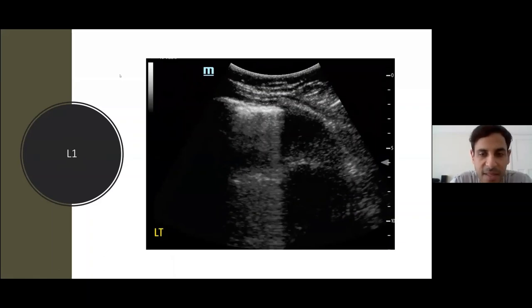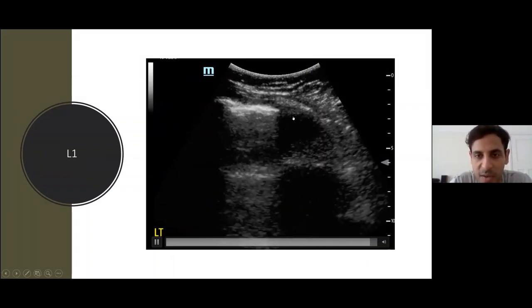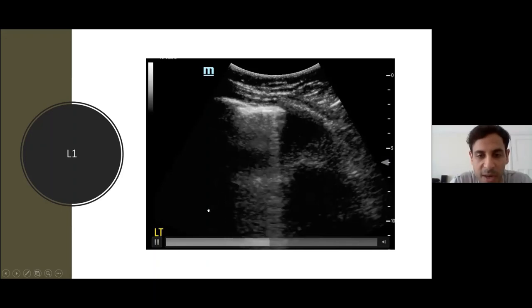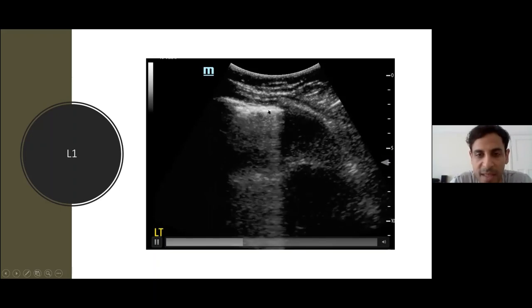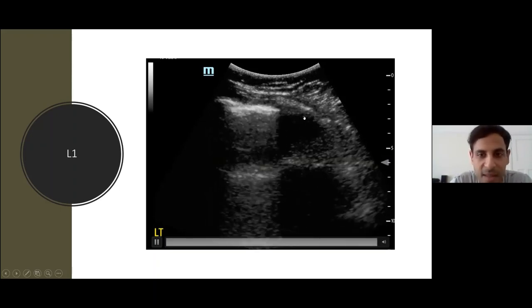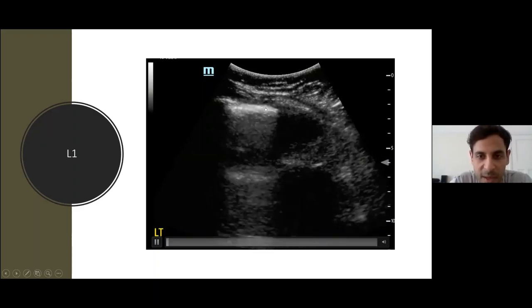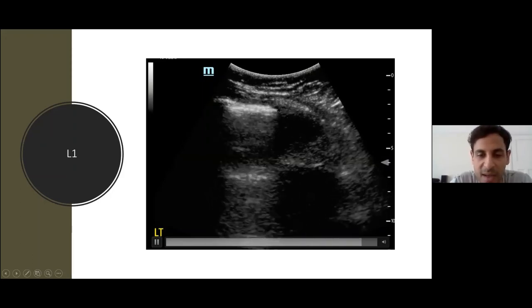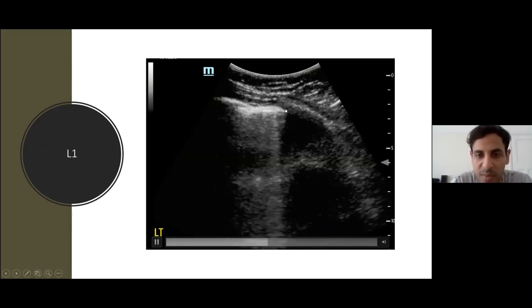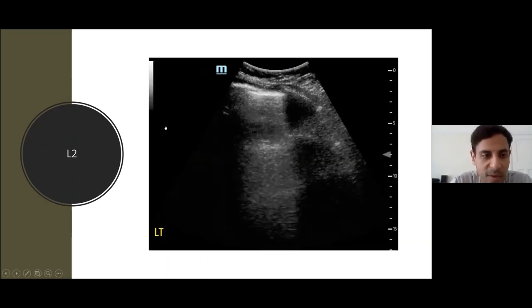Moving to the left. This is the left anterior superior zone, and immediately you can see something different. The pleura already looks thicker than on the right side, and as the patient breathes in, A-lines are obliterated by B-lines arising from the pleura. The B-lines become more confluent as the patient breathes in, and the pleura starts to become thicker and irregular.